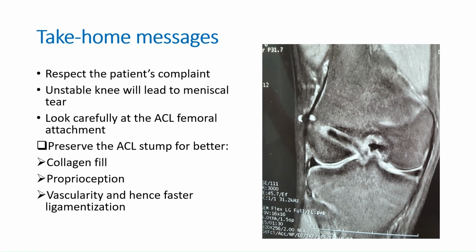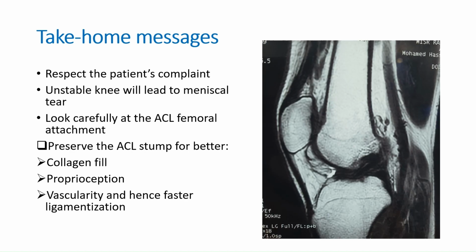This case had an ACL reconstruction, and the MRI was done in less than 3 months post-reconstruction, and we can see the excellent ligamentization after less than 3 months.